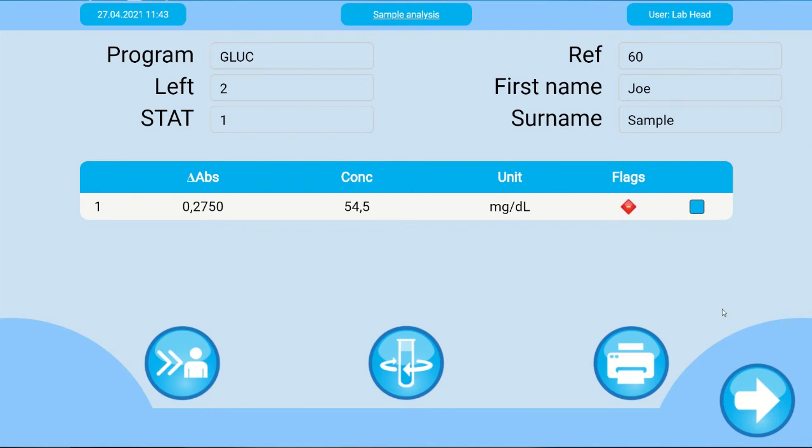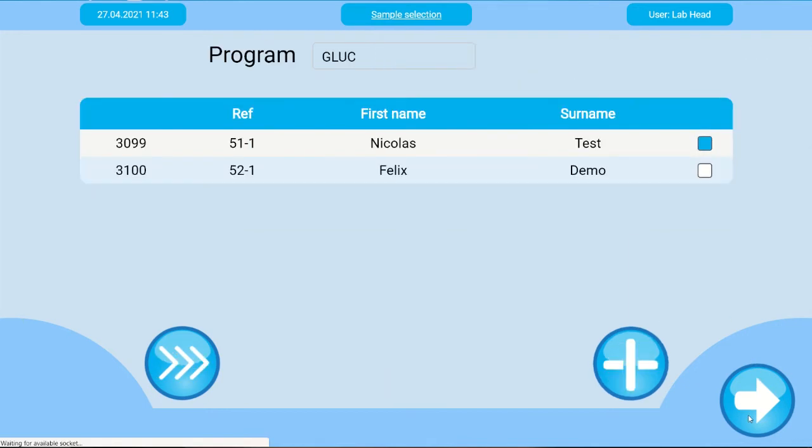We recommend to group the measurements together per analyte. It is therefore best to proceed with all other glucose tests now.